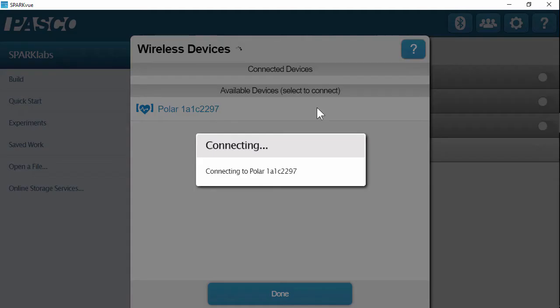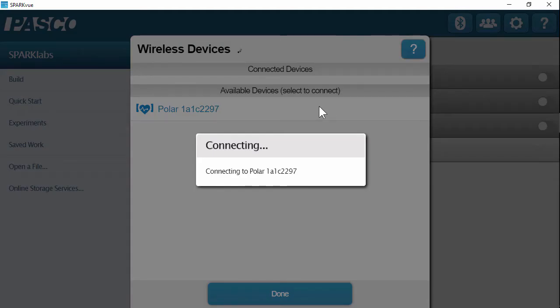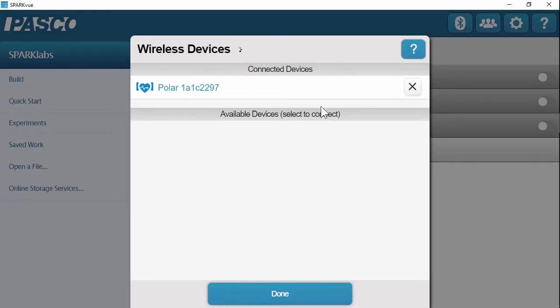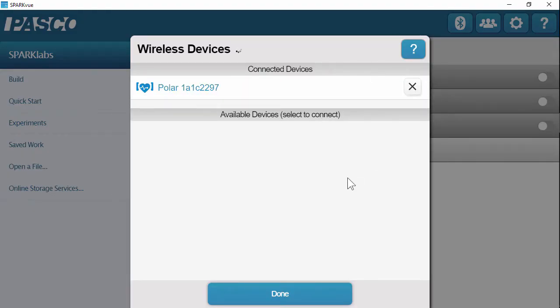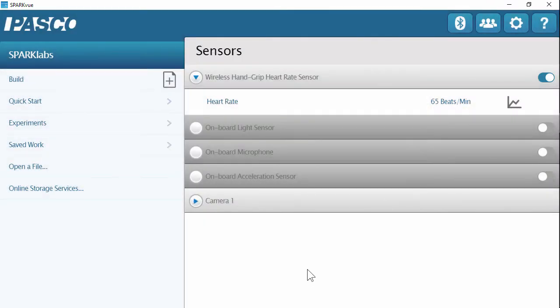I'll select the sensor to connect, and you'll see it move into connected devices within the software. I'll click Done to close the menu. On the home screen, we'll see heart rate in beats per minute.